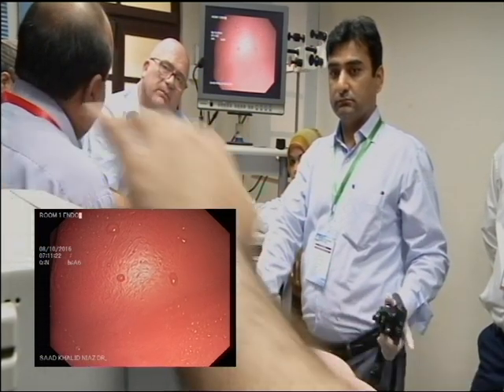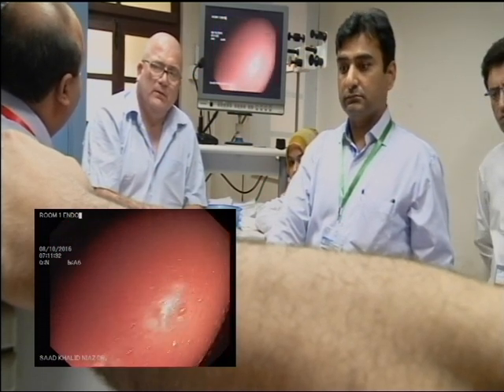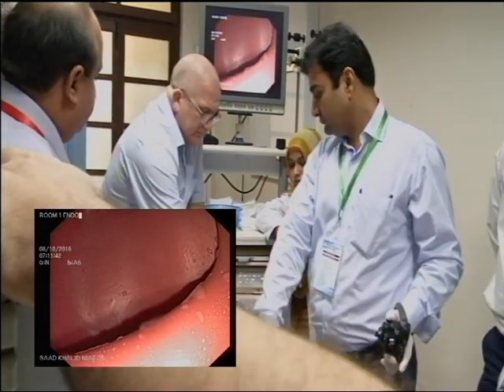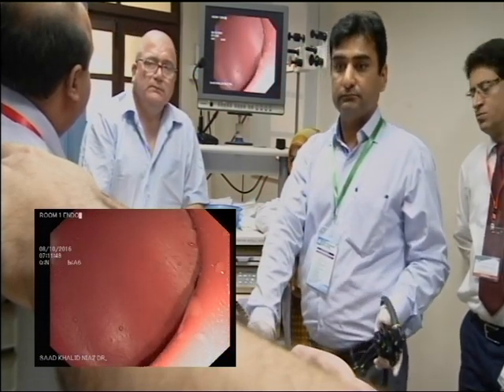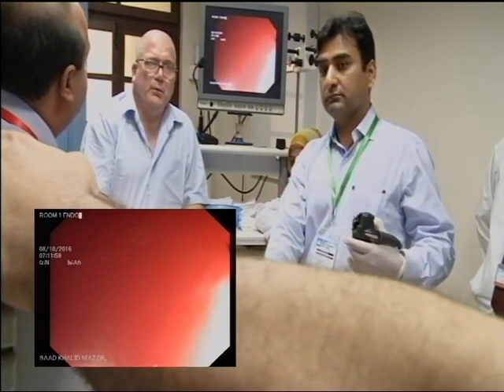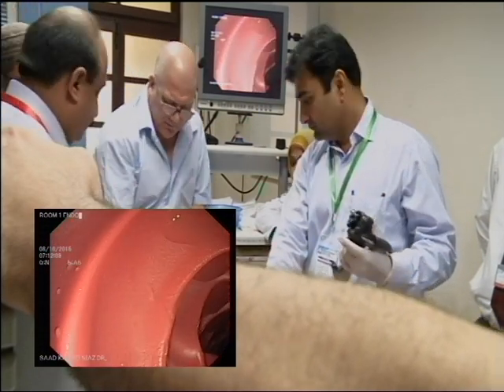Now, where's the lumen, do you think? Nine o'clock. Good. Now, where's the lumen? Excellent. Stop. Now, how's that feel? It's more okay. Excellent. Good. Where's the lumen? It's not forward with the big wheel, that's it. Good. Right, I'm going home, back to the UK, see if you can do it.